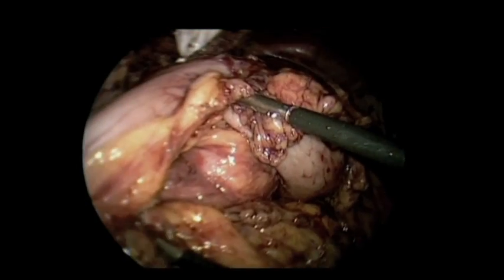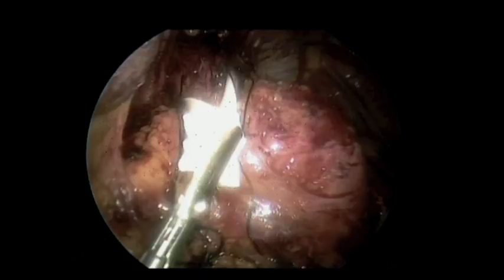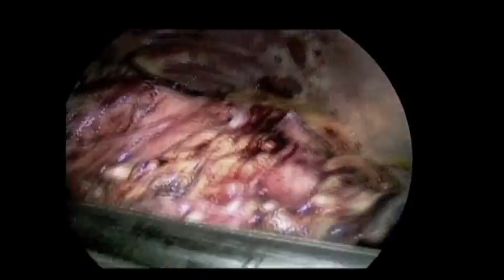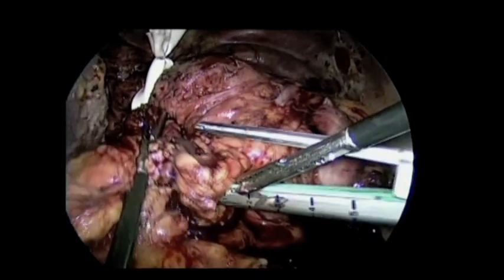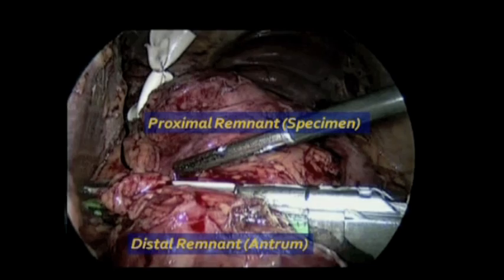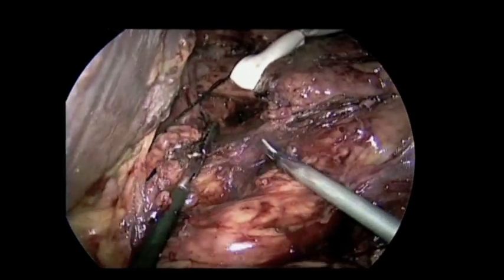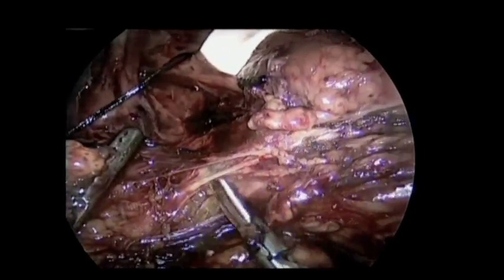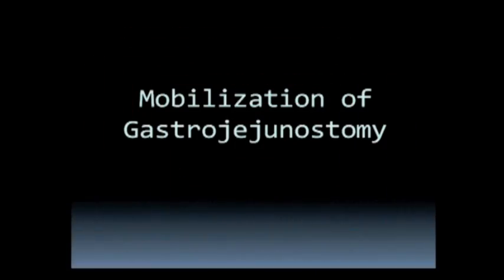The Roux limb is now defined. We went back up, placed two stay sutures on the esophagus, then back down and divided the gastric remnant transversely below the level of the gastric pouch. Although the gastric remnant was not communicating with the gastric pouch, it was plastered to the posterior aspect of the pouch. Considering the risk of perforation and cancer spillage, we decided it was not worth separating, so we proceeded with en bloc resection.